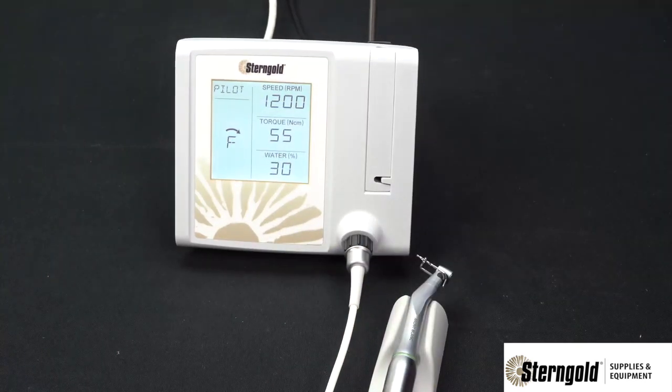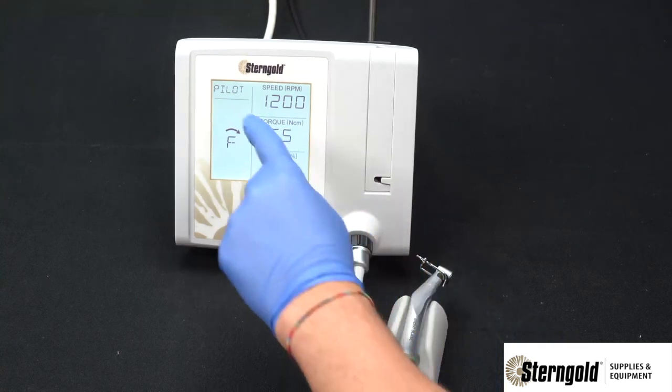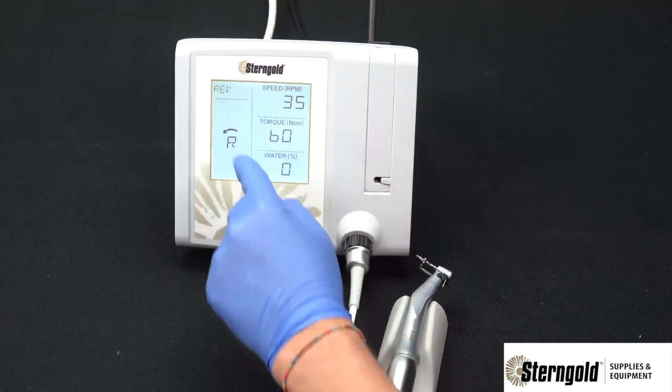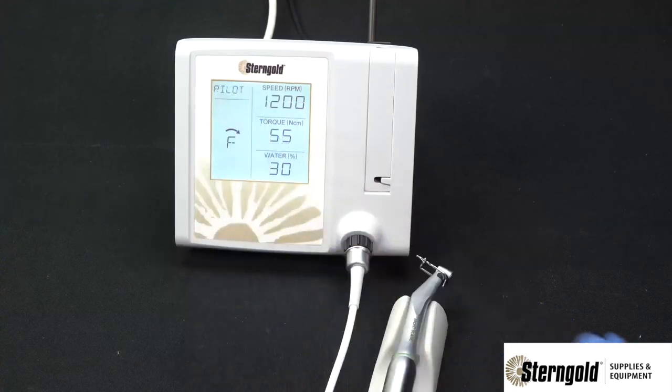The system has four factory set presets. To choose between them, simply press the preset section to cycle from pilot, to start, to final, to reverse, and back to pilot.